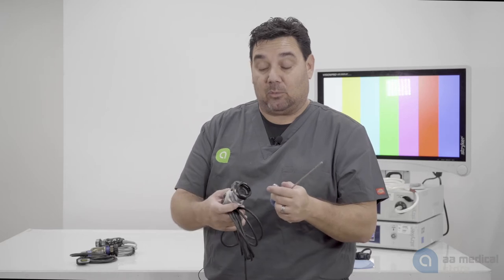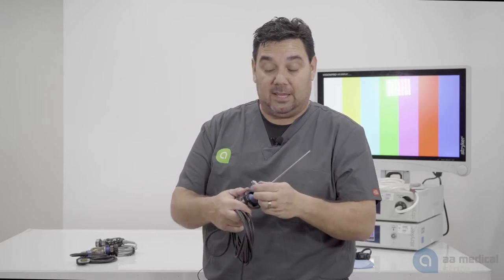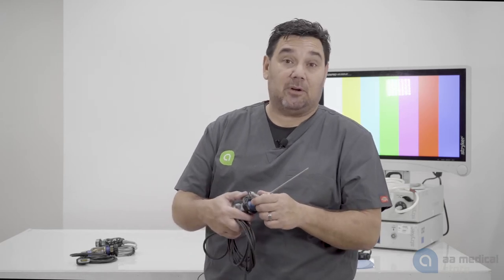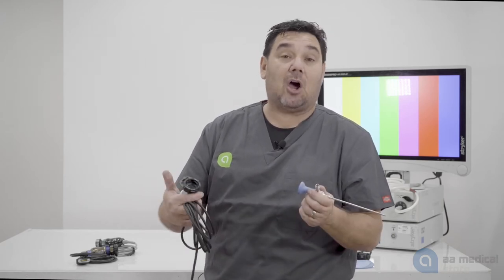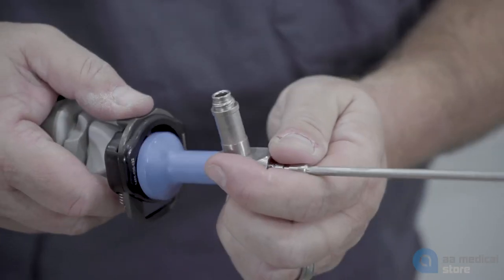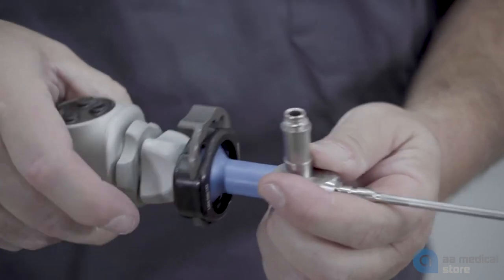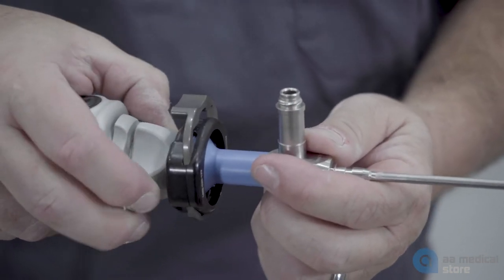The reason why they do it this way is for interchangeability during a procedure. If they wanted to change the angle of their scope from a 30 degree to a 70 degree, it's very simple and easy by just uncoupling the scope from the camera and then recoupling a new scope. The downside is your focus ring is now on the coupler instead of the actual scope.